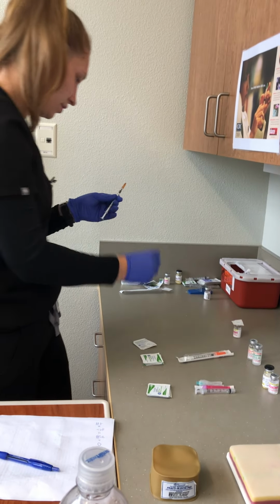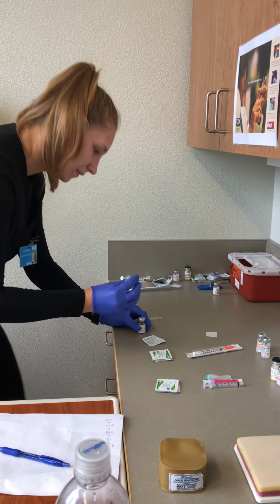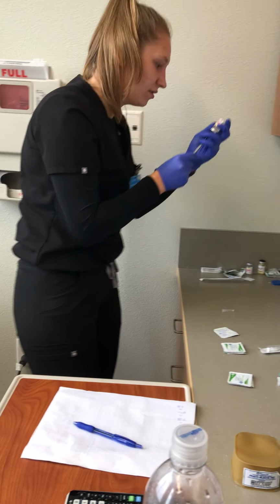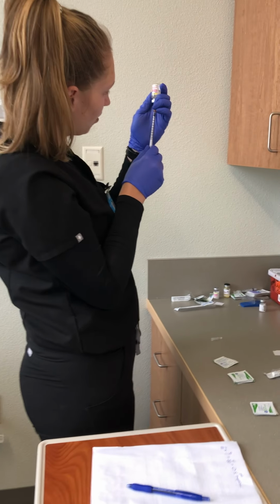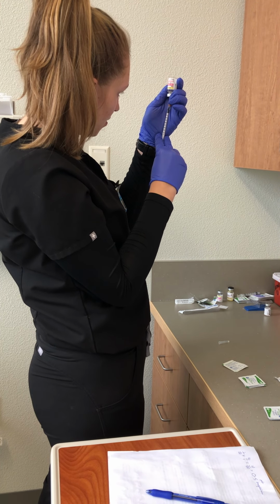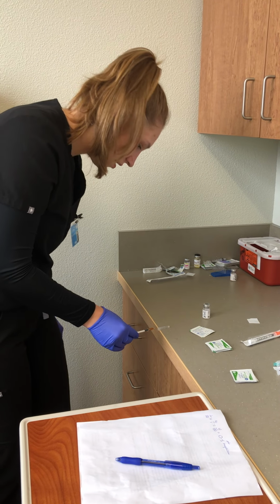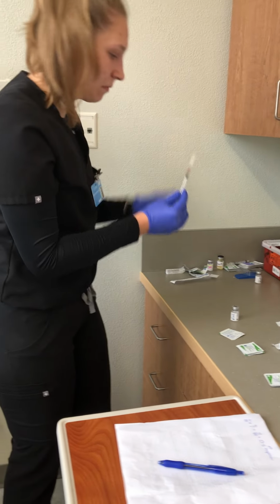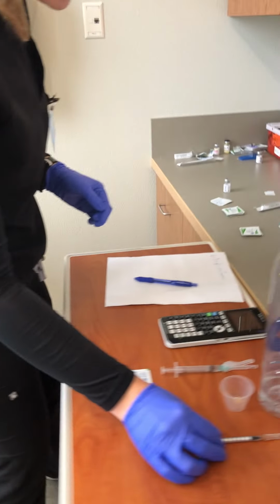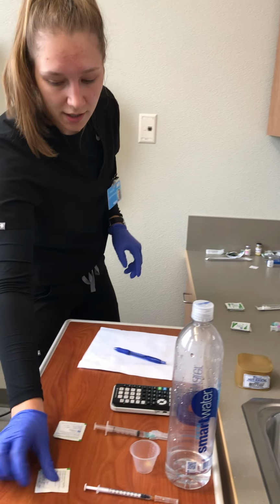I'm going to take this off, uncap this, move it over, and I'm going to inject 0.1 milliliters of air into it, and then I'm going to make sure I'm pulling back 0.1. I'm going to recap it. You see I have 0.1. Okay, I'm going to go ahead and set that off to the side. That was my second check performed with it. Let's set other alcohol swab there.